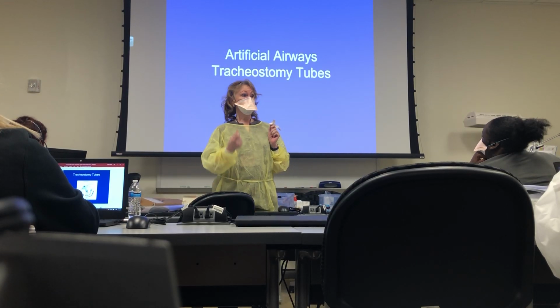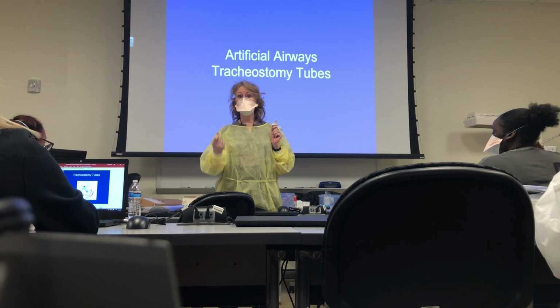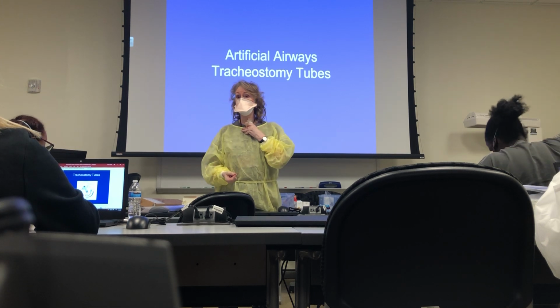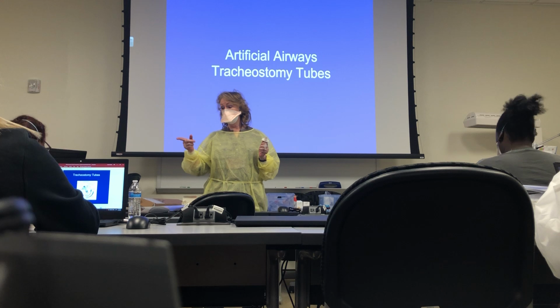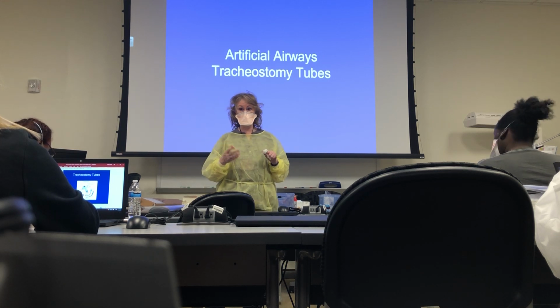Why? Because they want to save the vocal cords. The longer the tube is in, the more irritated the vocal cords are. So they take out the ET tube and they put in a tracheostomy tube, okay? The most common type of tracheostomy tube that you will see in the hospitals are these, either Portex or Shileys, okay, that's the brand name.